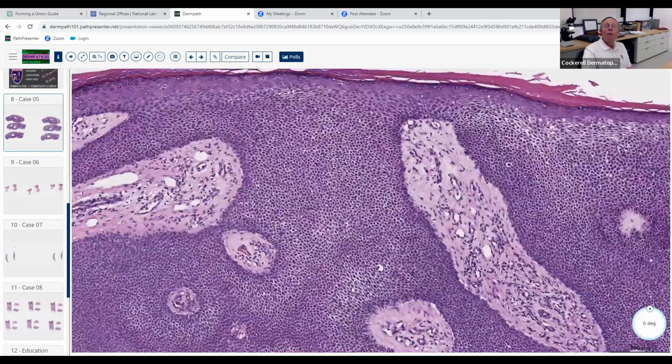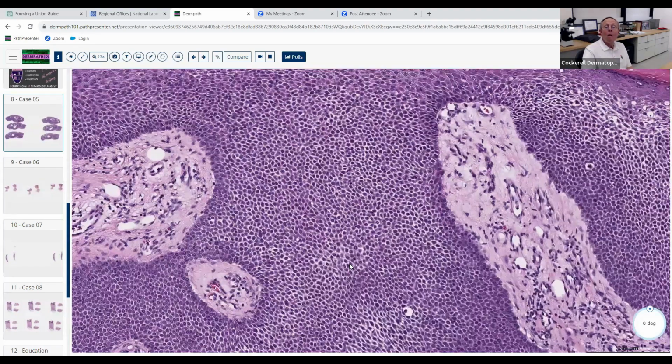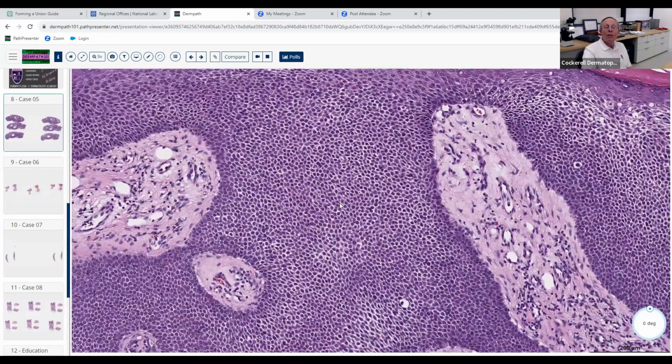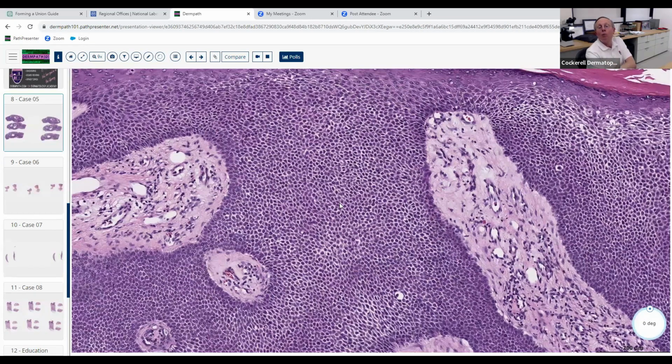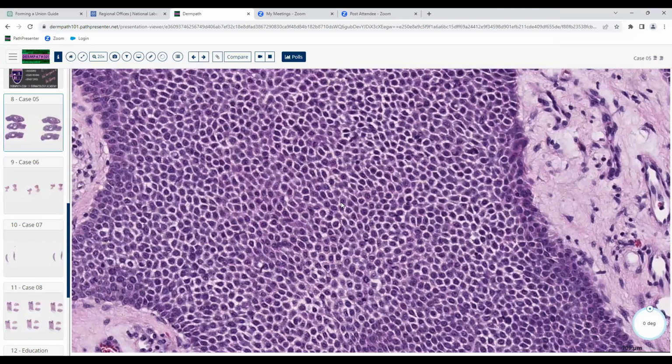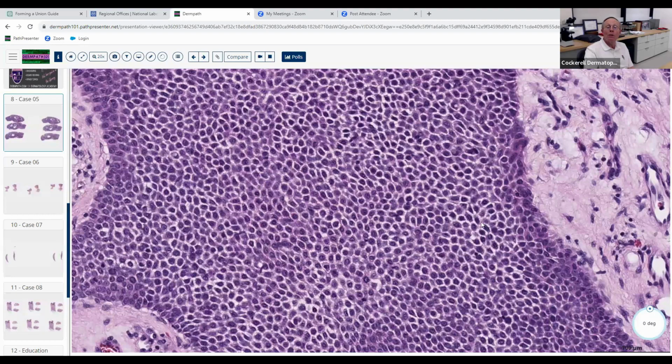And now, what do you see? This is also one of those, you've got to kind of imprint it in your brain so you can recognize it. There's a lot of blue cells here. It looks like they had some spines on them, if I'm not mistaken. Yeah, there's definitely some intercellular bridges. They're a little bit expanded here.